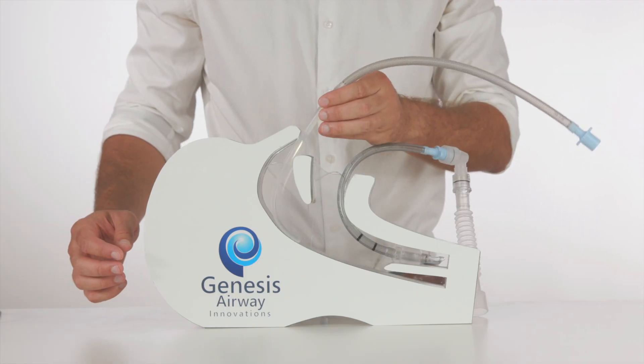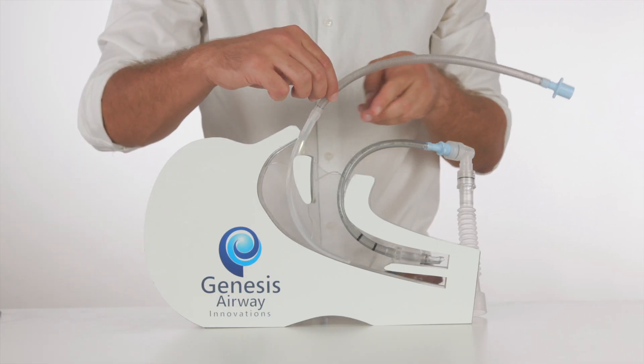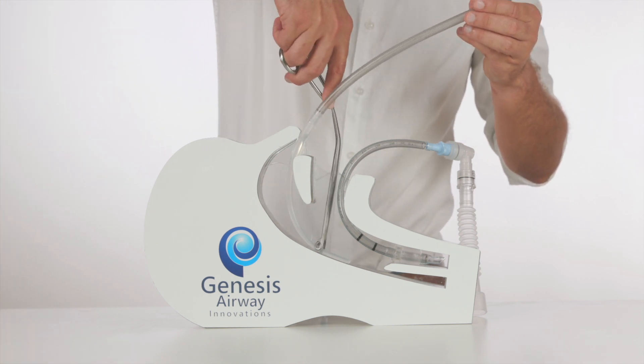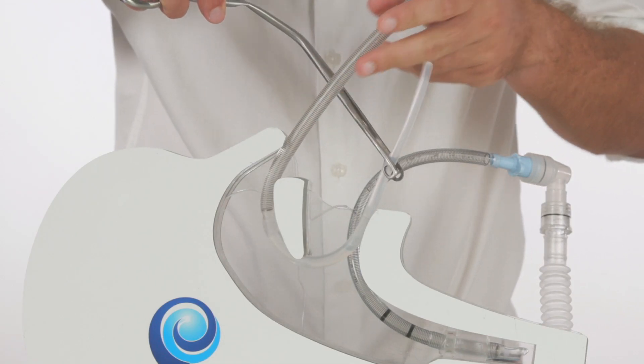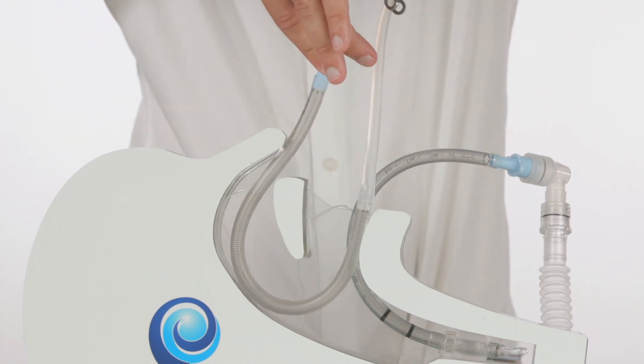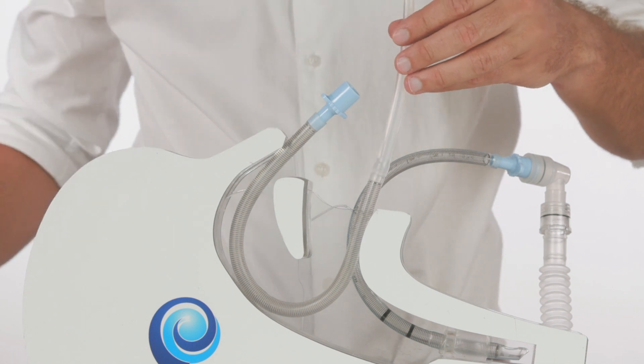Using the most patent nostril, the atraumatic introducer is advanced into the nasopharynx. Once visible within the oropharynx, the introducer is then retrieved with McGill's forceps, applying very gentle traction whilst continuing to advance the airway tubing through the nose.